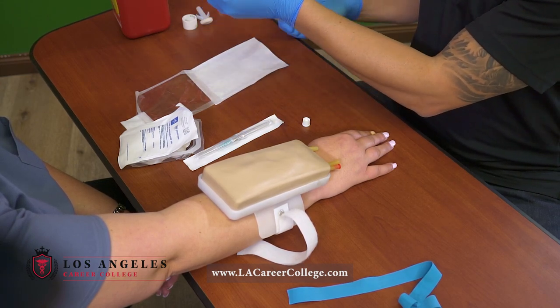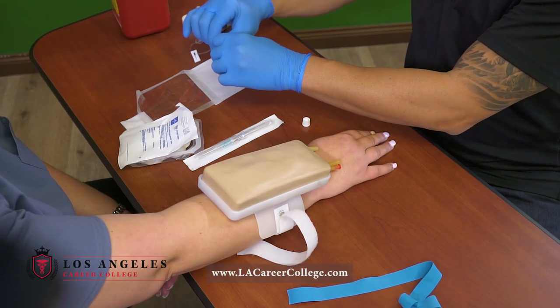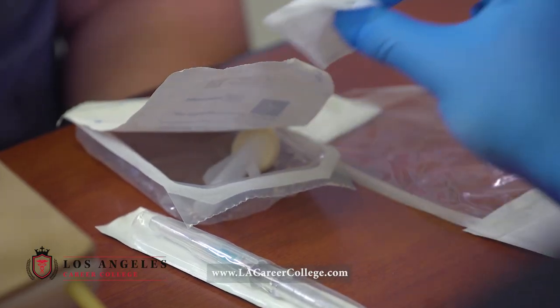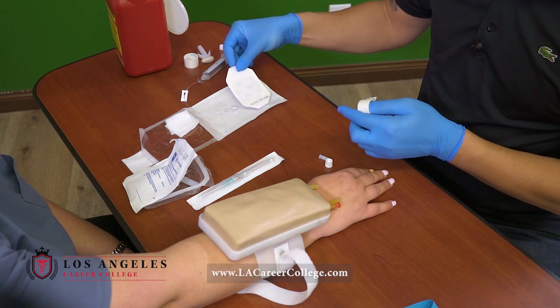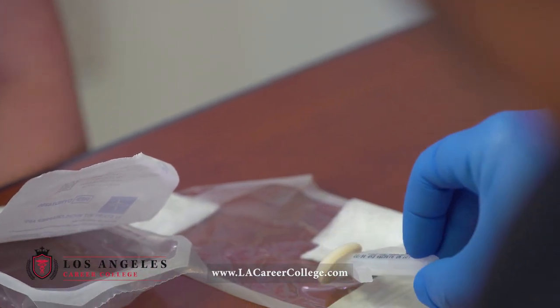I'm gonna go ahead and prime. I'll go ahead and take this off just like this. I'll go ahead and place my gauze here. I'll go ahead and place my Tegaderm right over here, along with my alcohol.